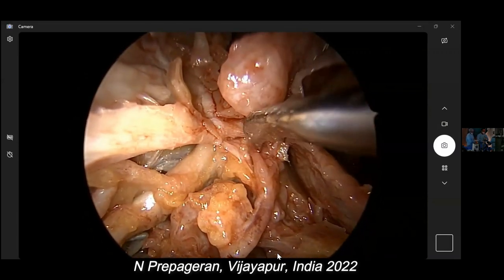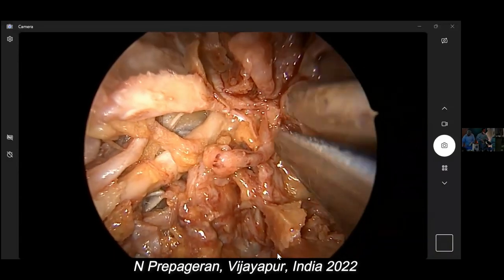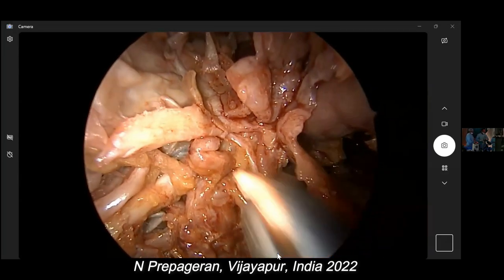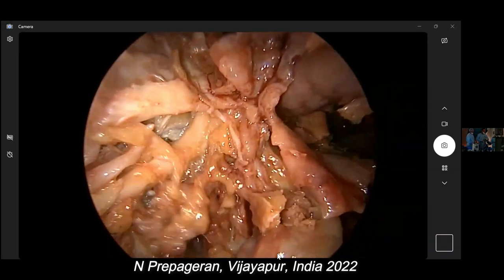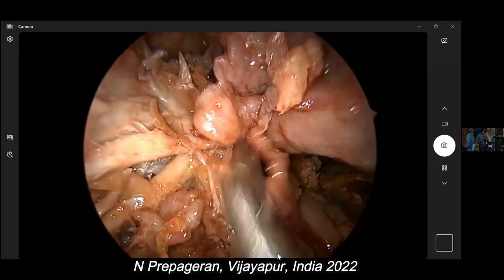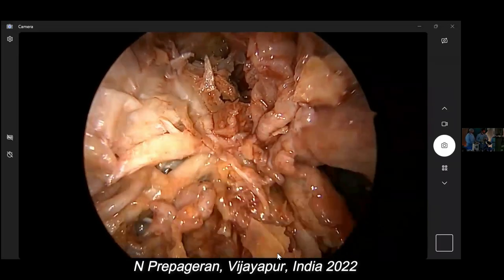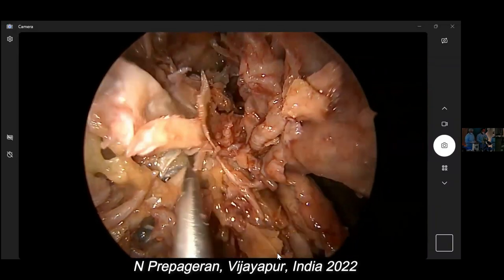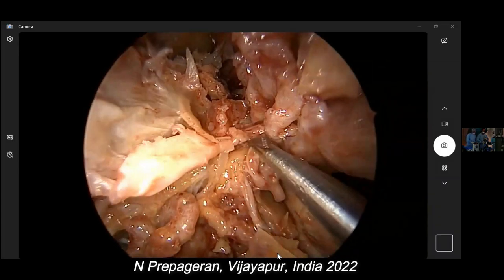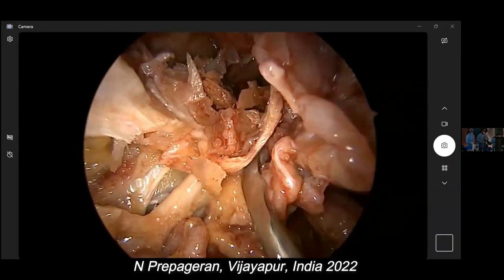Let me cut the sphenopalatine artery. That's the artery, can you see? I'm going to clip, first clip, second clip. Push the artery down. Push the artery down the same way here. So now what we are going to do is we are going to look for Vidian nerve. So once we open up this plane, dissect a little bit more here. Push up all the soft tissues. And that should take us to the Vidian nerve soon.